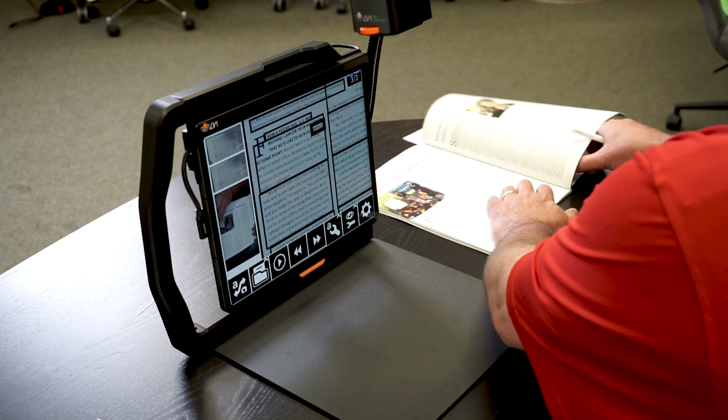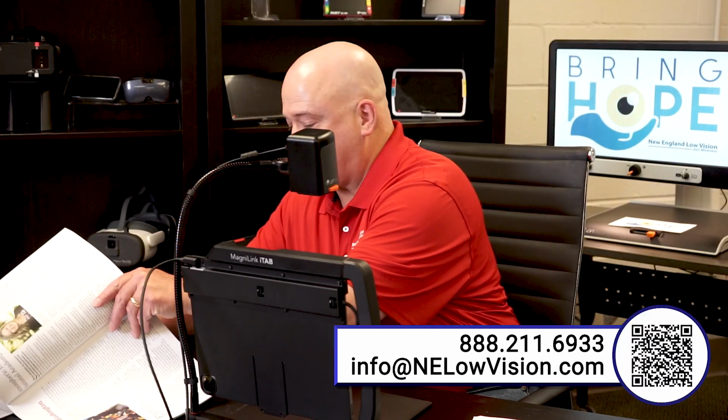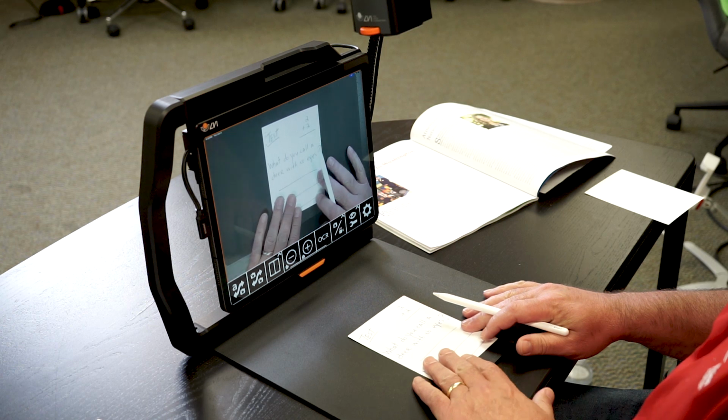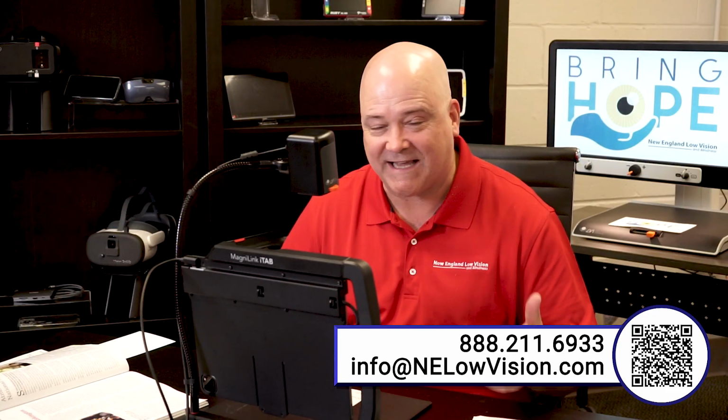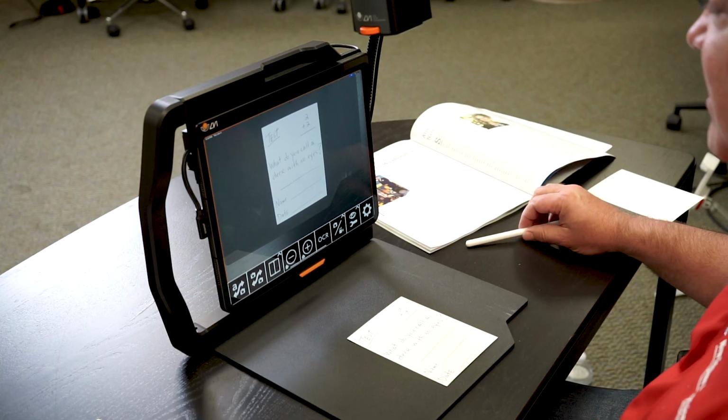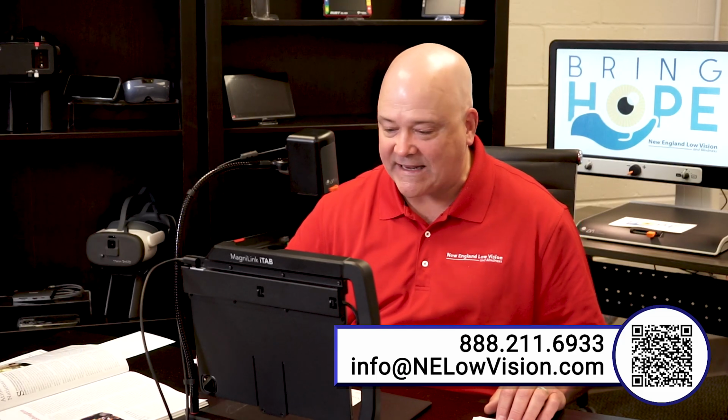So now what I want to do is, instead of showing you the text-to-speech, let's do something simple like marking up a document. So let's just see if we can save this document. We're going to go back to the camera and we're going to show you a test. This is a test I just made up. So think of your test in the classroom with some simple questions on it. Let's scan that in right now.